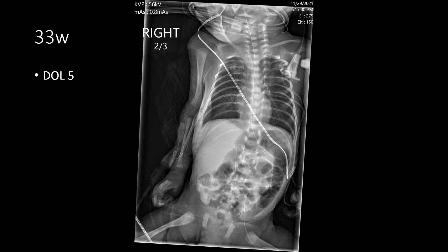Here we have another premature infant on day of life five needing central venous access, with a number of illustrative catheters. One catheter is in the right upper extremity, with insertion likely in the forearm or antecubital fossa. For whatever reason they were unable to get the catheter to advance further, and it is located within the axillary vein. It is acceptable to use for some medications and fluids, but it is suboptimal due to the lower flow and less central location of the axillary vein — it can be used sparingly or in an emergency.